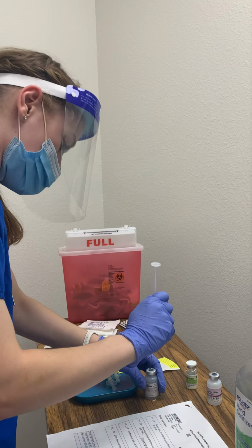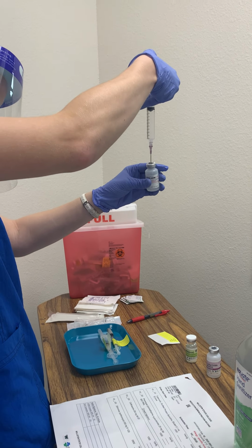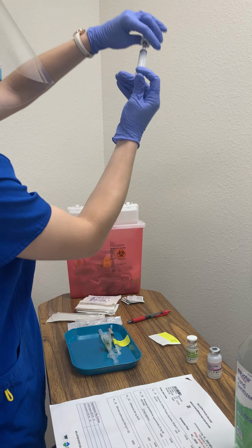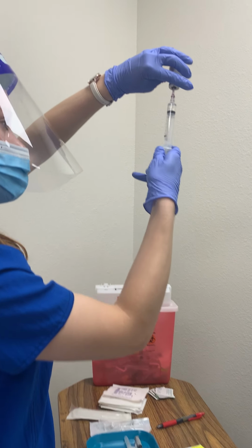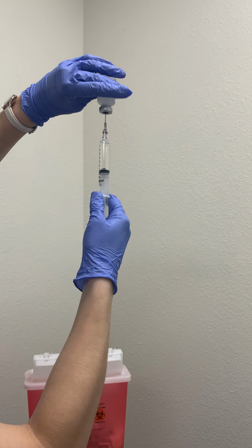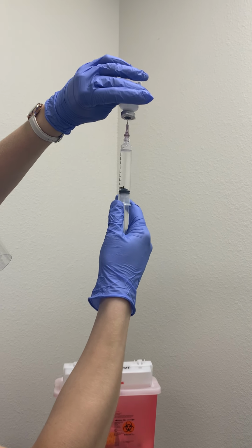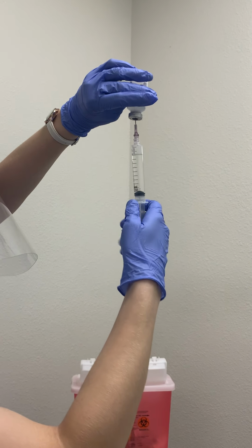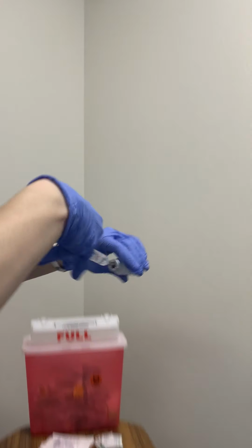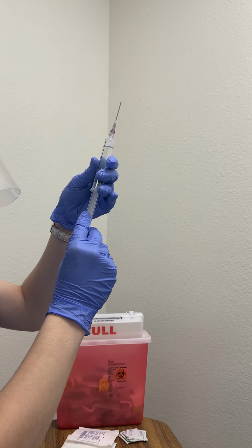And then above the water line. There we go. This is how it's actually supposed to go the first time. So I'm just going to be drawing a little bit back farther. Enough. So let me push up.